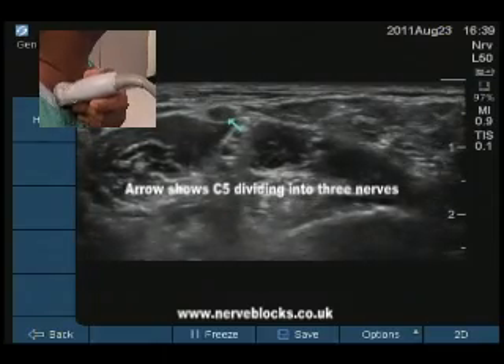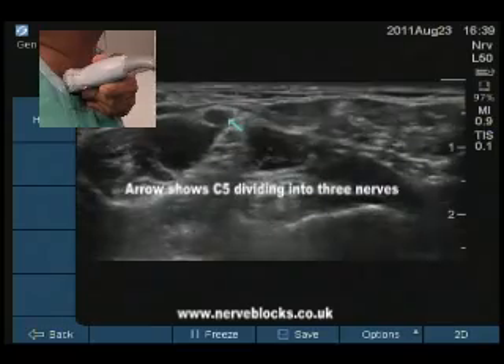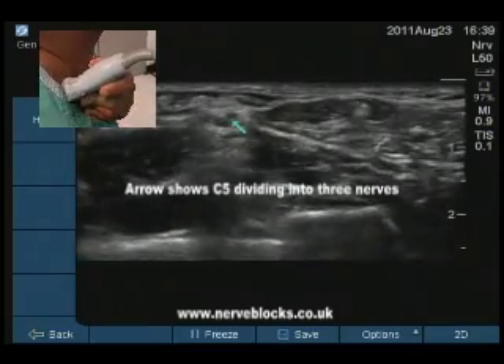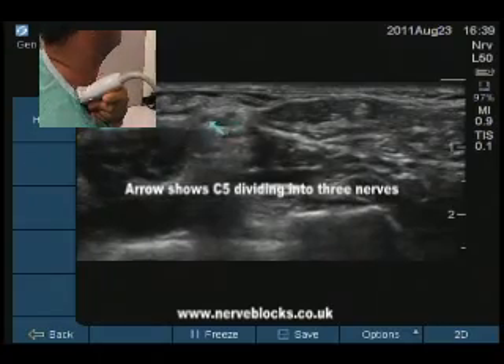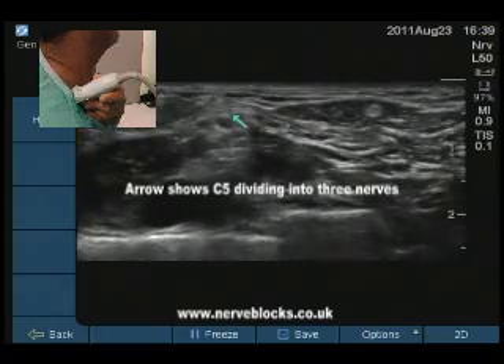Recording? Yeah, recording. Plus C5 there. Scanning now. C5 divided into 3. Can we show 3 parts with the arrows? 1, 2, 3, okay.